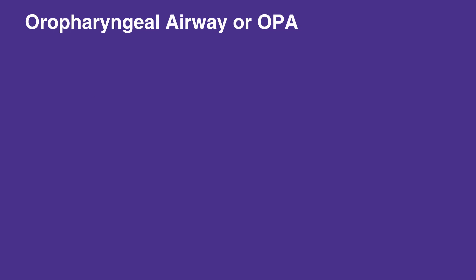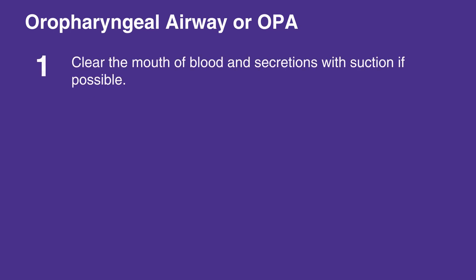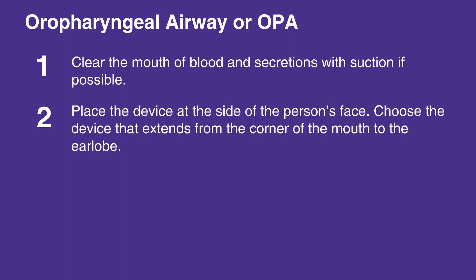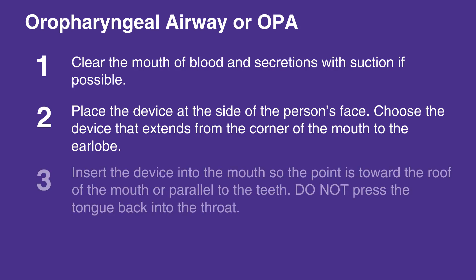To insert an oropharyngeal airway, or OPA, first clear the mouth of blood and secretions with suction if possible. Place the device at the side of the individual's face. Make sure to choose a device that extends from the corner of the mouth to the earlobe. Insert the device into the mouth so the point is toward the roof of the mouth and parallel to the teeth.